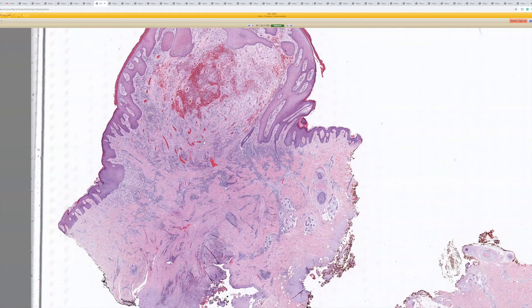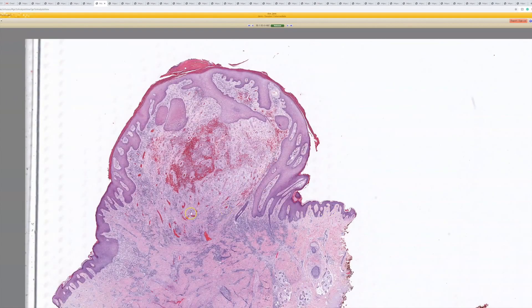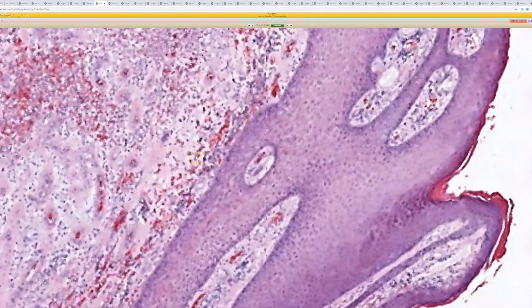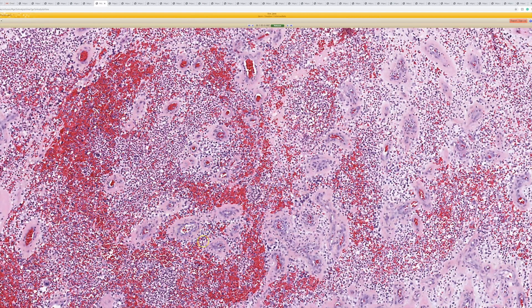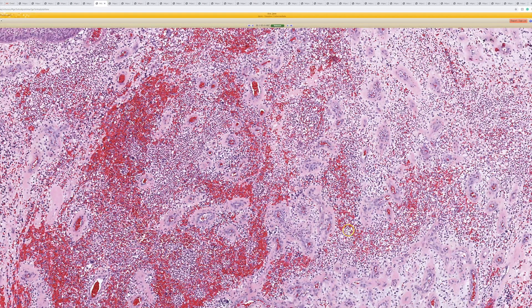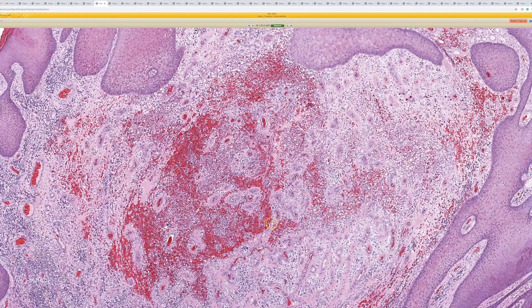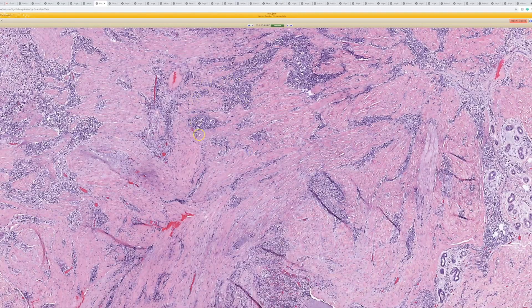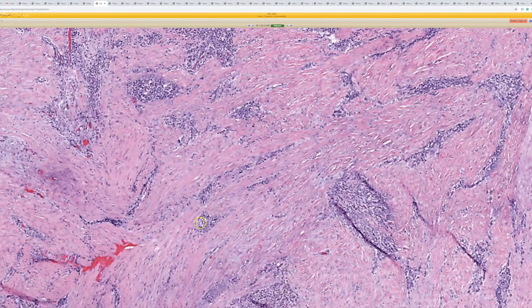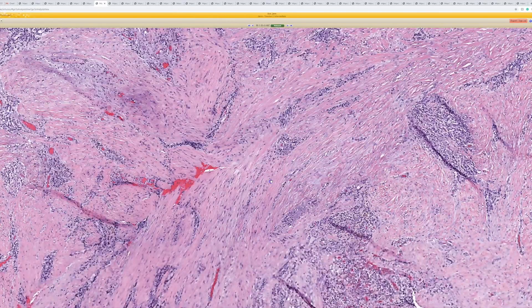The key in these kind of situations is the clinical and the location. This is the skin surface here, but we have this bulging overgrowth where you have really reactive acanthosis of the epidermis. If we zoom in, there's hemorrhage, there's reactive blood vessels, there's a loose myxoid background — so this is basically granulation tissue with hemorrhage. And then down deeper, there's inflammation and the granulation tissue becomes more dense and collagenized.